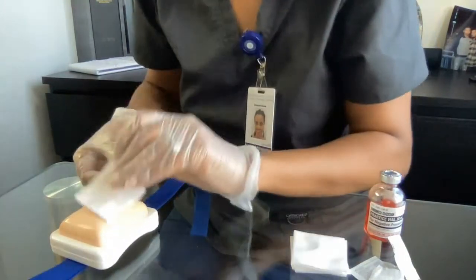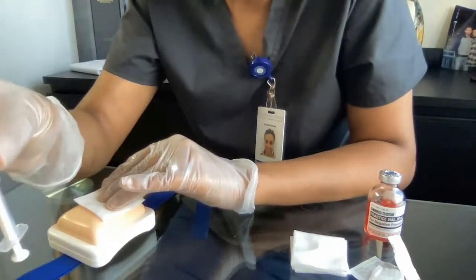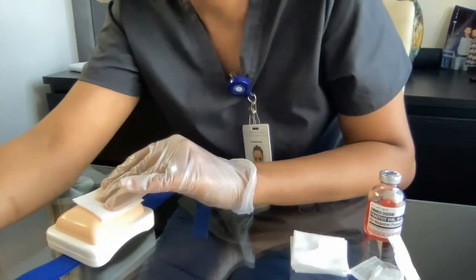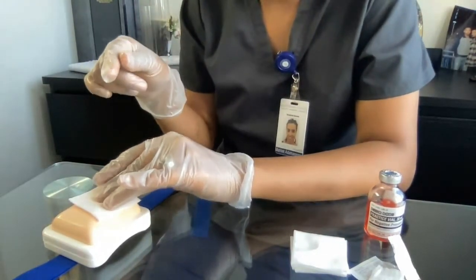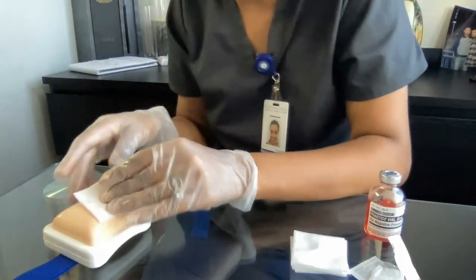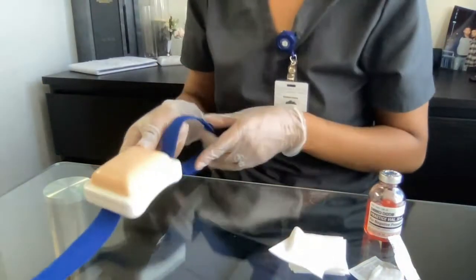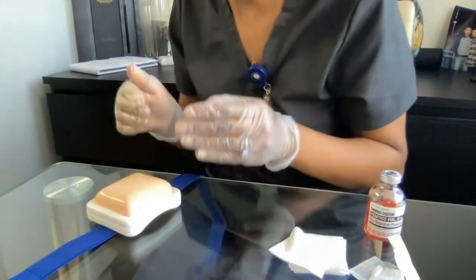I'm going to grab the needle and discard it in the sharps container to prevent needle stick injuries. After disposing of it, you can see there is a small wheal — we need to measure it, and it should be 6 to 10 millimeters. If it falls within that range, it means the injection was performed correctly.